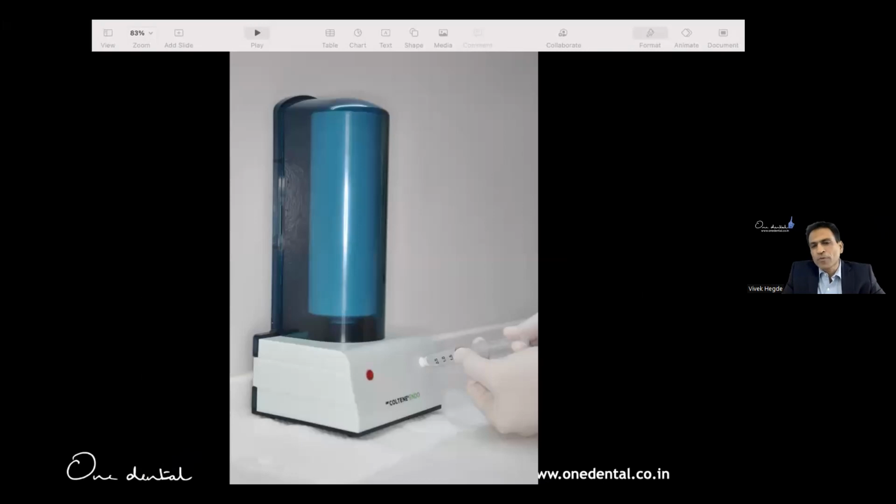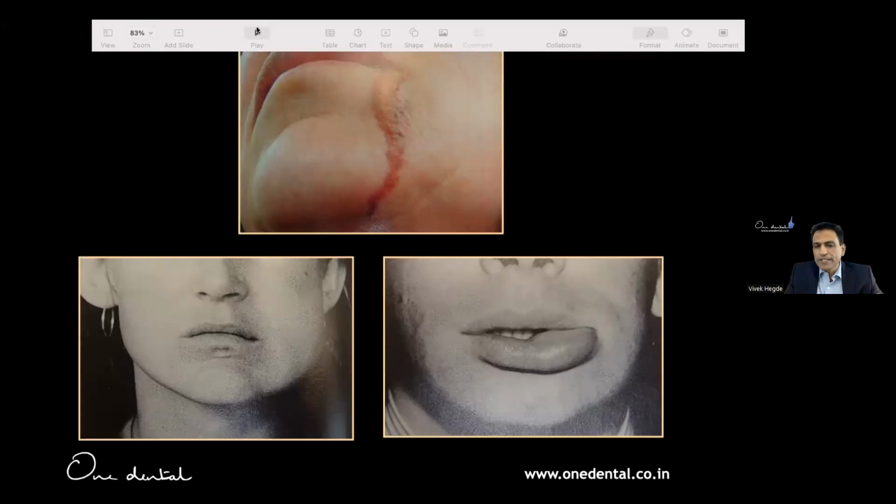Why am I speaking so much about all this? I have seen accidents. In my consulting practice, some dentists used to start and I used to go after that. And I ended up seeing a lot of accidents. I can't put the real pictures, so I've just picked up some textbook or internet pictures. This top picture that you see is drooping down here. The dentist was not wrong. The dentist was focusing straight on that molar, the mesial canal. The needle was there, but the attachment where the needle and the syringe were tied up, the thread was not there and it was leaking continuously.